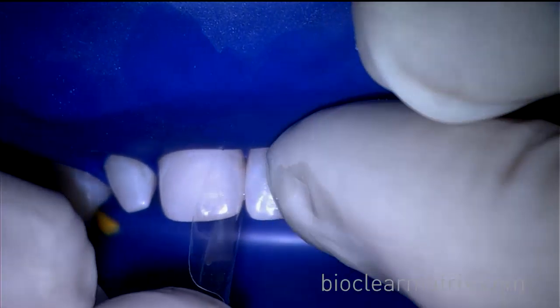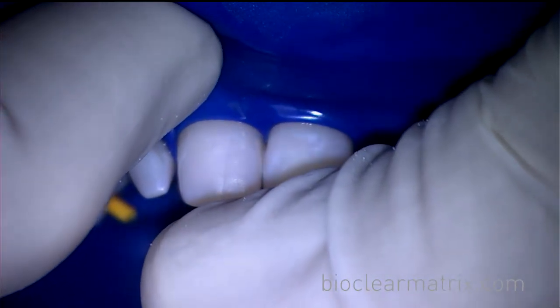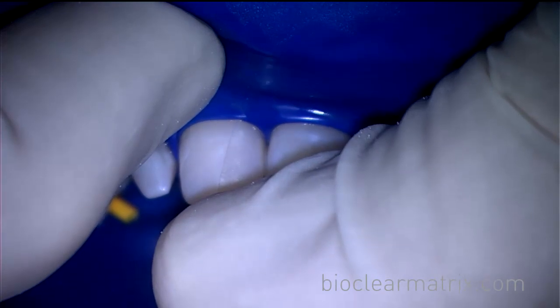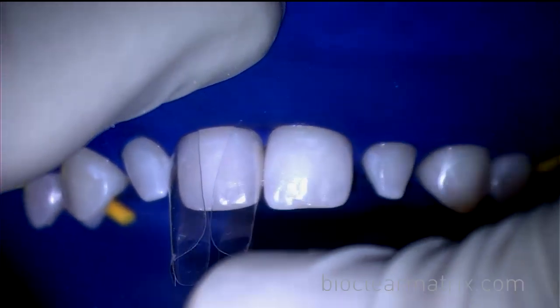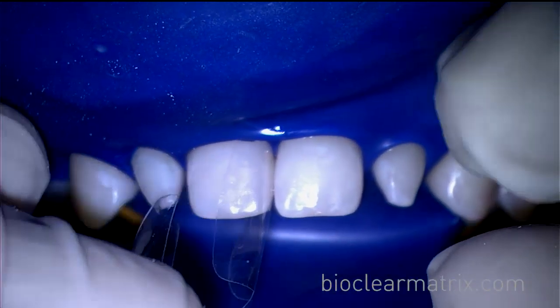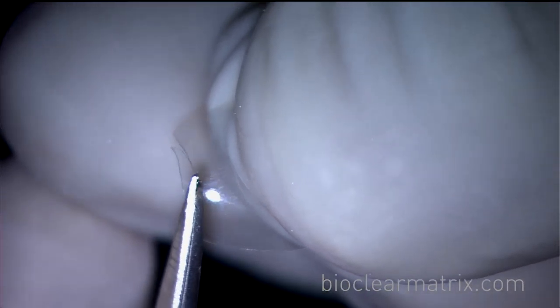In this case, the teeth are undersized. Therefore, Dr. Clark used an A103 small incisor matrix on both the mesial and distal of the center. You can see here that the matrices are not fully seating due to the patient's young bone. Using the micro scissors to trim the matrix will allow the matrices to follow the rise and fall of the attachment and allow for better seating.